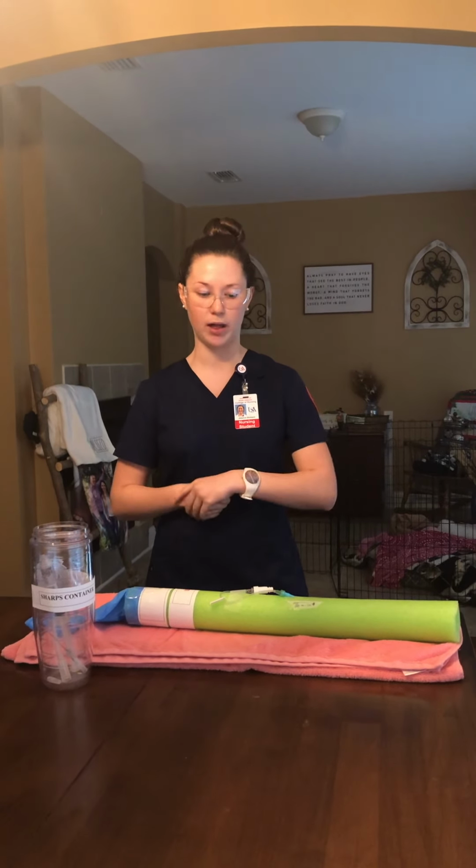vein. So the next thing I'm going to do is lower the bed and raise the side rails. I'm going to position the patient comfortably and safely, and then I'm going to explain to the patient ways to prevent dislodging, as well as signs and symptoms of IV complications. So this would be things such as infiltration, inflammation, or phlebitis.